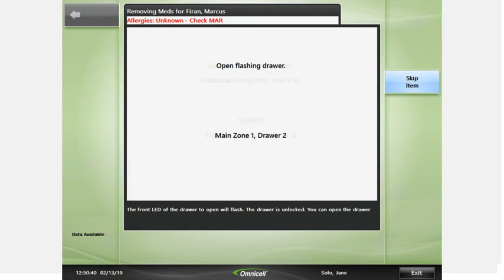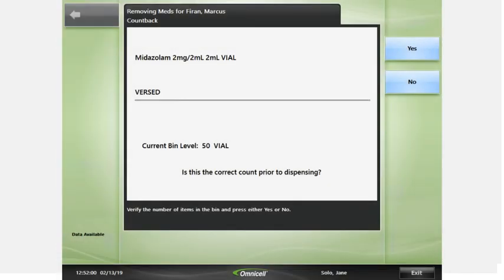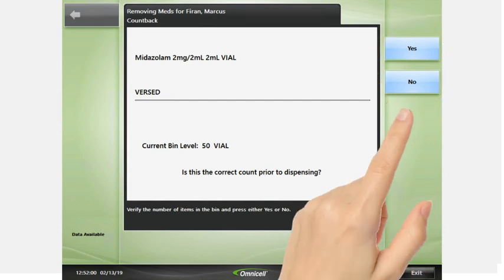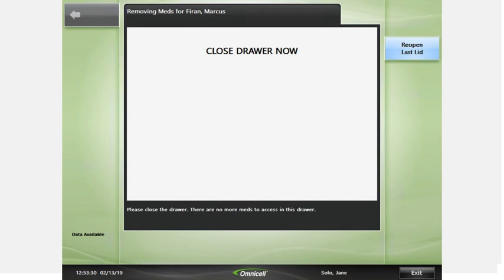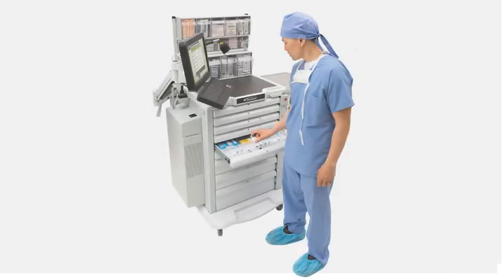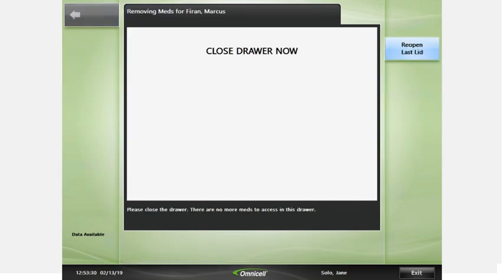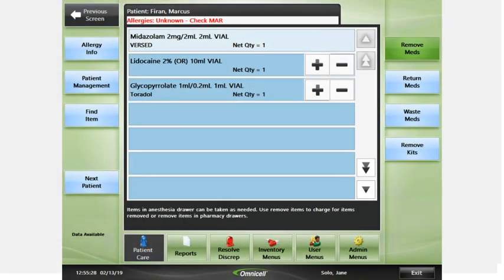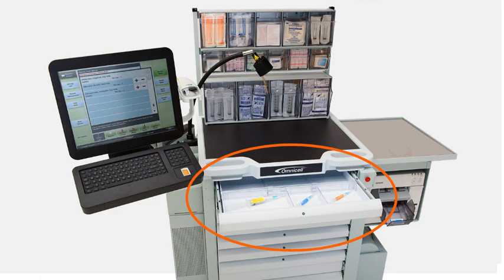Follow prompts and guiding lights to access items. If prompted, confirm or edit the correct count for the item. Close the bin and drawer. For non-narcotic items, simply remove them from open anesthesia drawers. Adjust quantities as needed using the plus or minus buttons. Close the drawers when done. Place the items into your designated anesthesia work drawer until you need them.